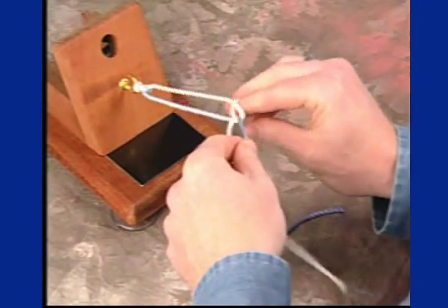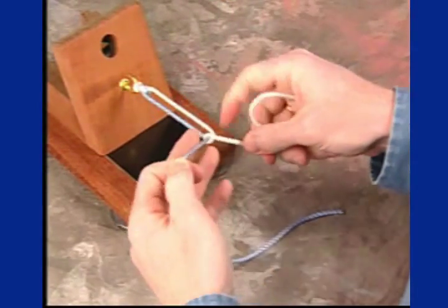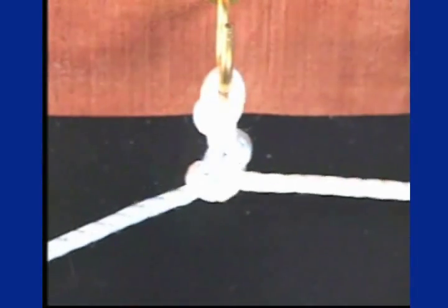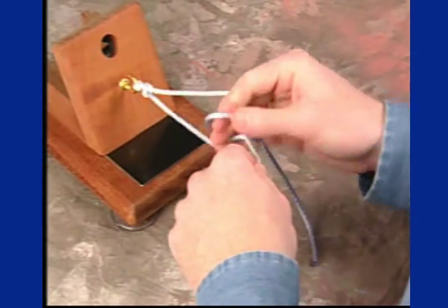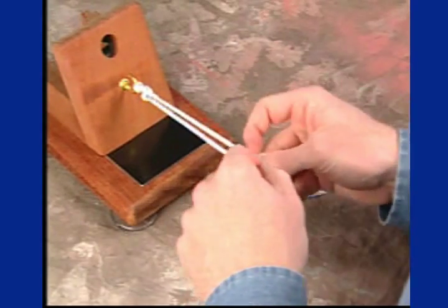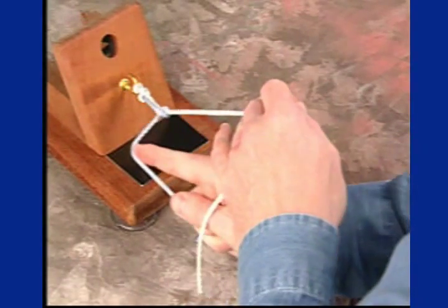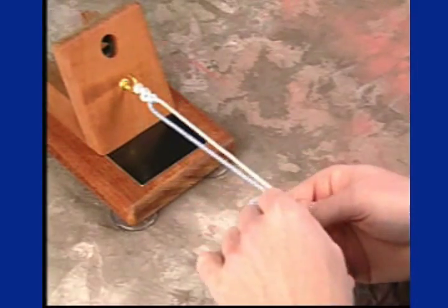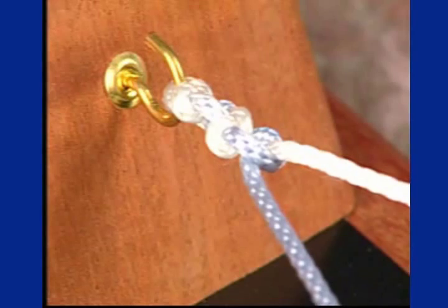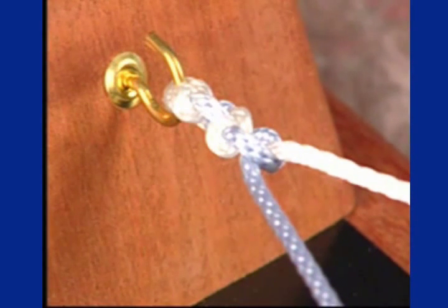You again alternate your post and then do a half hitch in the opposite direction from the previous. Three half hitches allow for good security. The demonstration here just shows further half hitches, emphasizing the point of alternating posts while alternating the throws of half hitches, demonstrating good half hitch knot tying.